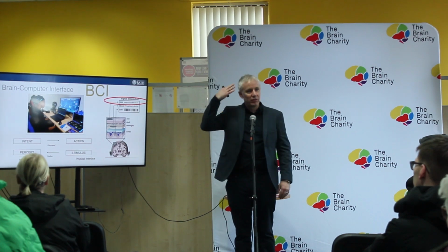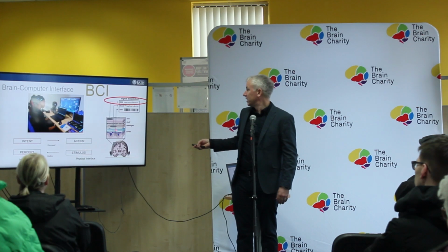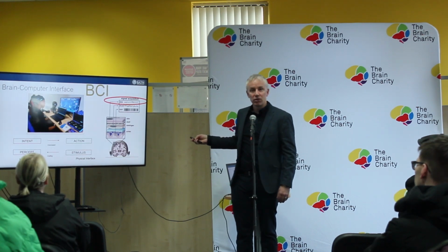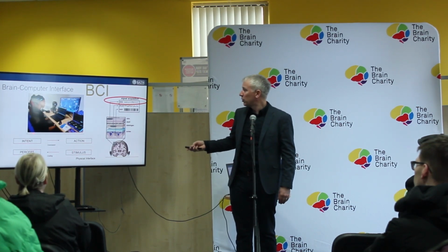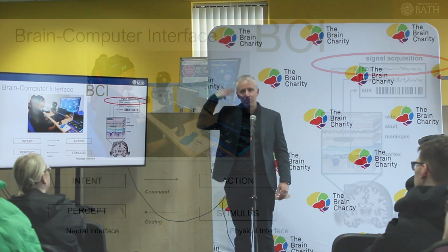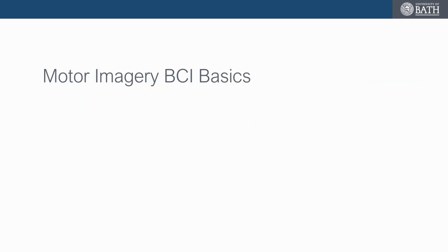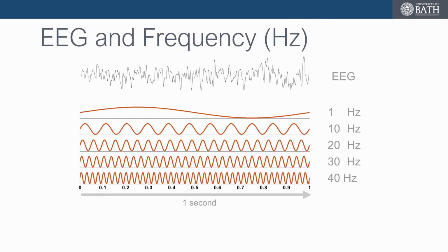We focus non-invasively, so we don't measure any signals inside the brain. We're always measuring signals outside the brain. And normally we get people to imagine movements or perform some mental task, and that modulates brain activity, and then we translate that into a control signal. So how do we do that? We use a thing called motor imagery.